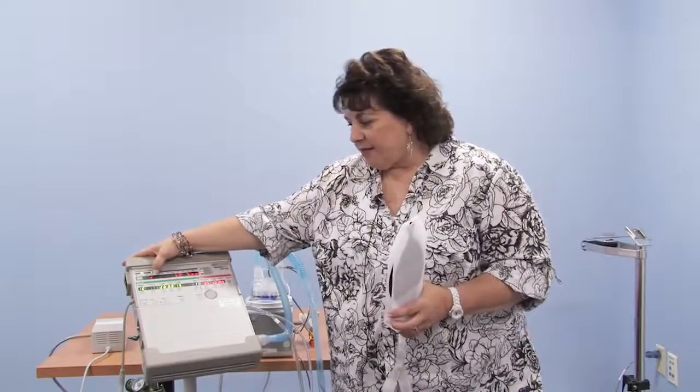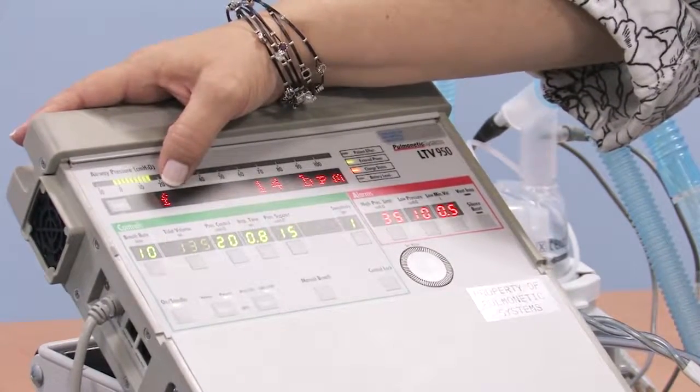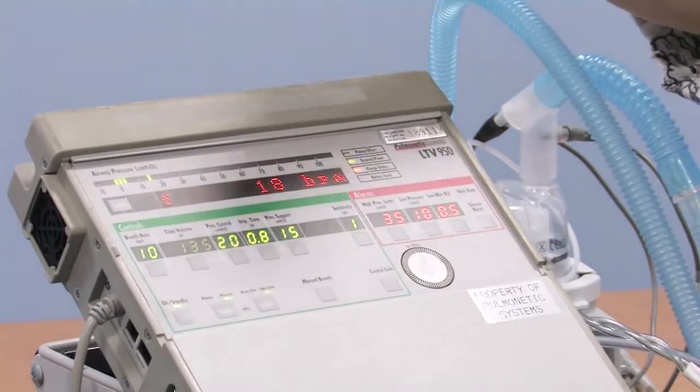Next comes F, which stands for breaths per minute. And all of these things will be in the manual. They will be in handouts that you'll likely be provided by those that are training you on the ventilator. Why they use some medical terms, I don't know, for parents. But F is breaths per minute. And it does say BPM, which sort of leads you to that.